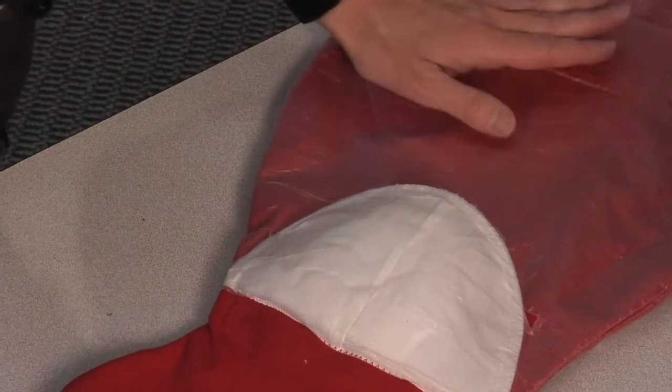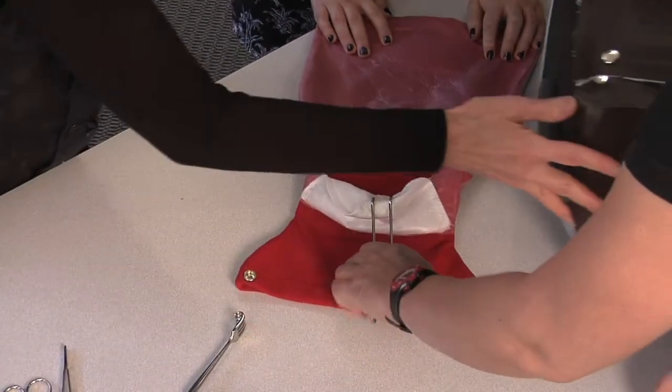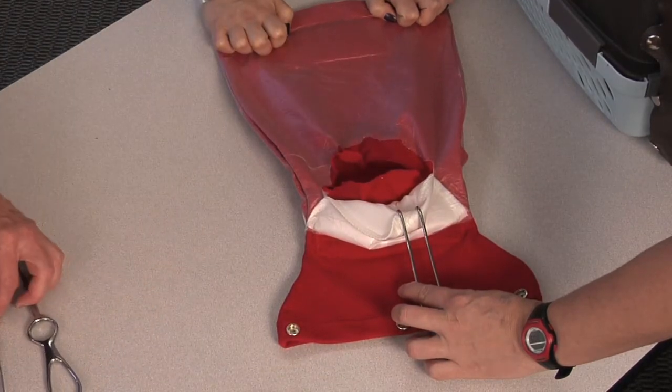Can I ask you to steady that there? We'll just move this out of the way so you can see. There's our uterus — the baby and the placenta are out — and now we need to sew.